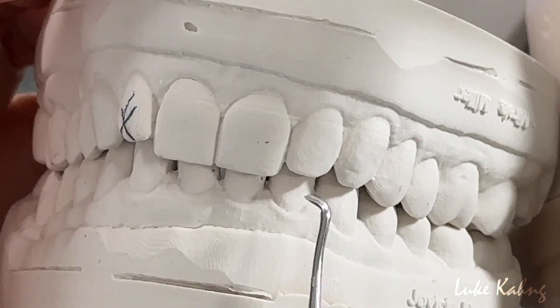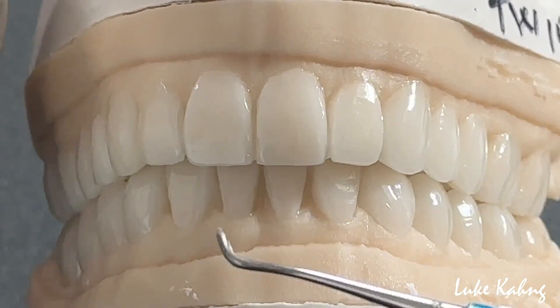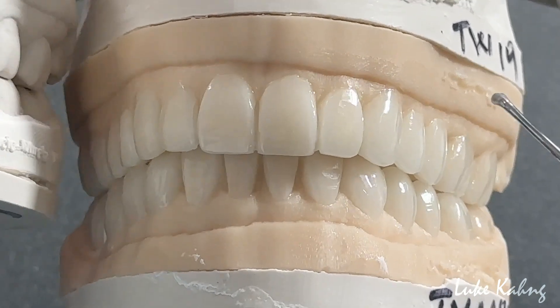I also make a little step down on the teeth. Usually people like harmonized teeth — golden proportion teeth — they like that. This is not a bad contour; it's natural.